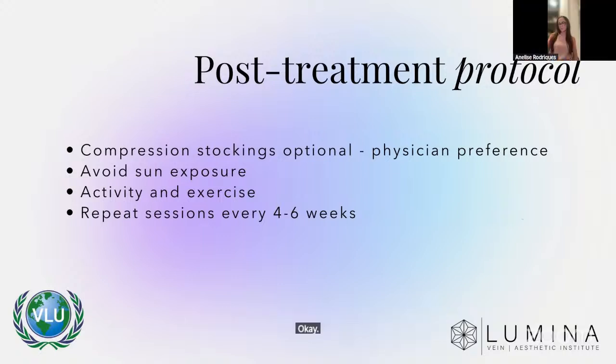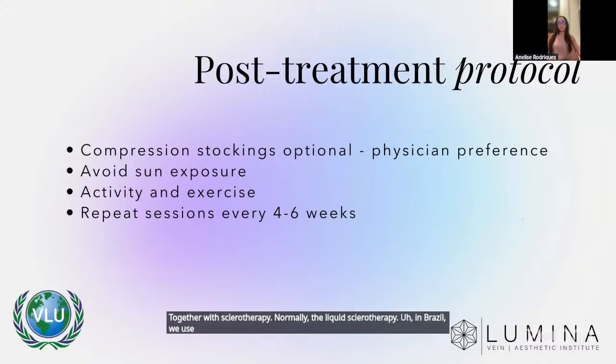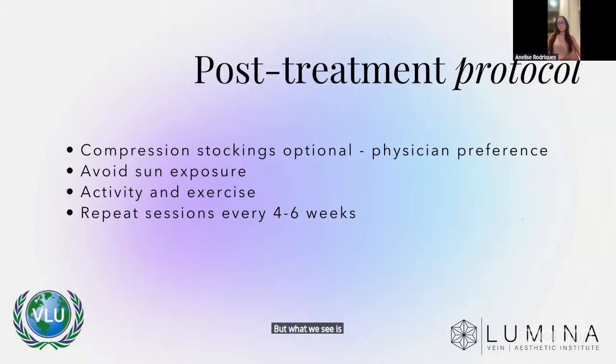Okay, so basically the CLaCS is the association of the transdermal laser, the 1064, together with sclerotherapy, normally liquid sclerotherapy. In Brazil, we use it with dextrose. I know they don't have this in the US, but what we see is that we have a synergic action of the laser with a lower intensity, together with a low to medium power sclerosant. So we have lack of adverse events with actually a very good result in the end.